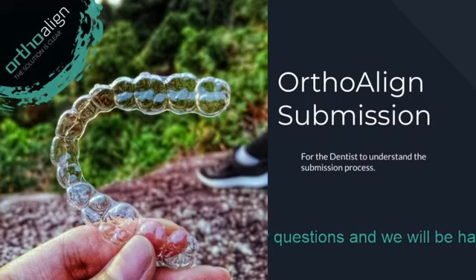As we know, STL files are the universal file format for any open system to accept scan data. It is also important, when you take your intraoral scan, that you ensure full coverage of all the teeth, all the dentition in the patient's mouth. If there's any missing data in the scans, they may be rejected. For example, if you do not capture enough of the sulcus area, then you're definitely going to have problems. Our orthodontists will let you know that there is not enough data in order to do the aligners.